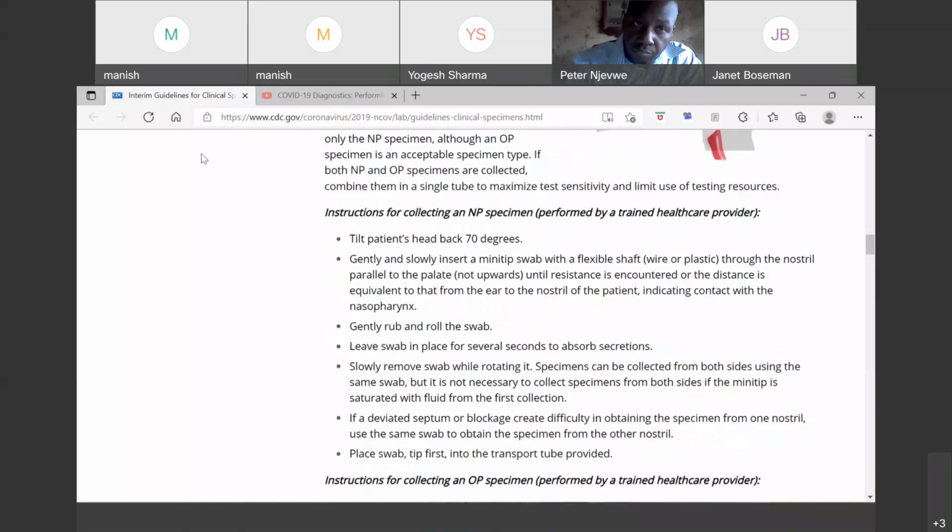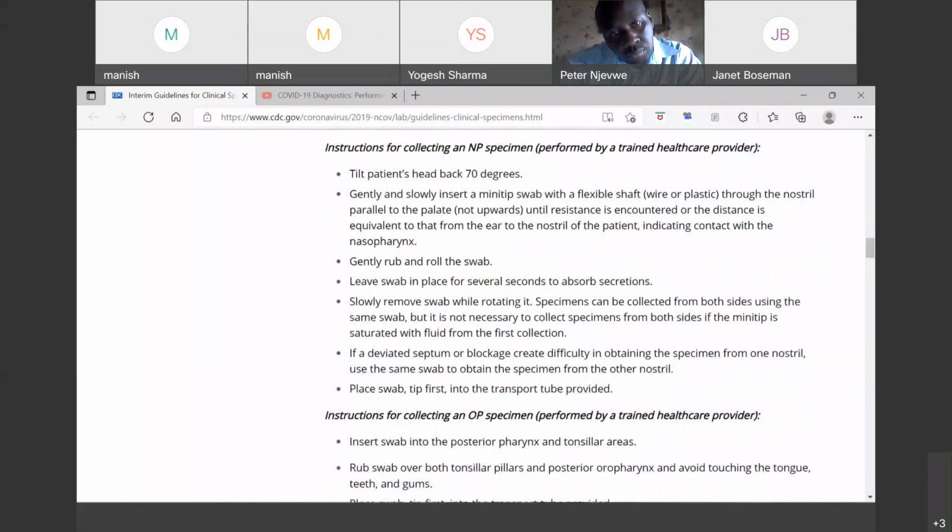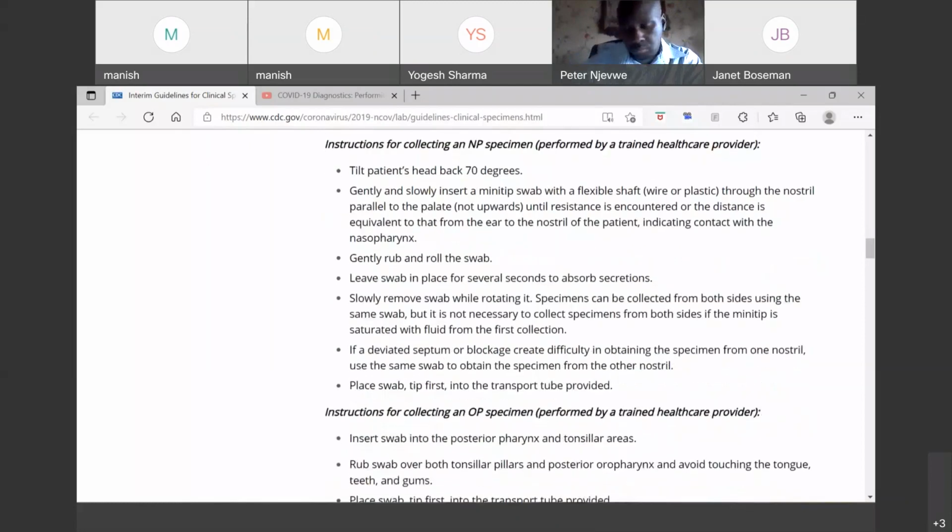Collection of the NP specimen is to be performed by a trained healthcare provider. Tilt the patient's head back by 70 degrees. This I'm going to show in the video also, and as Gaurav has told you, you are already having the video. So later on, after that training, you should go through the video and the guideline.